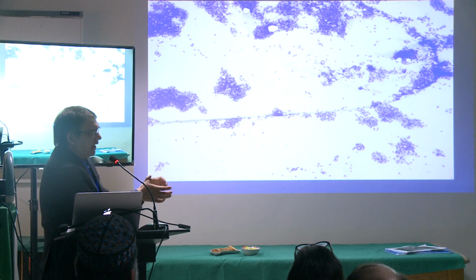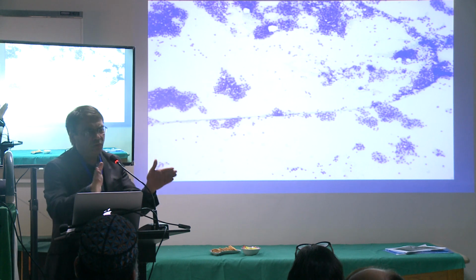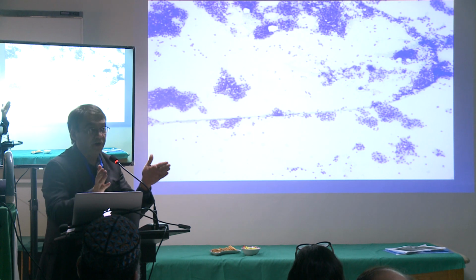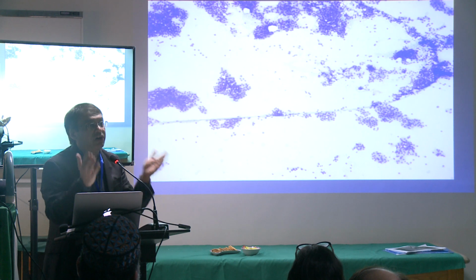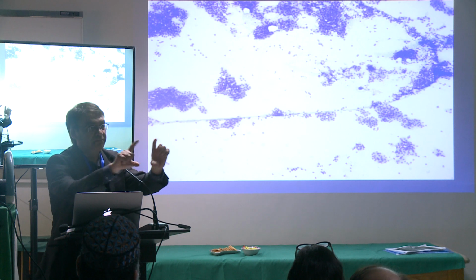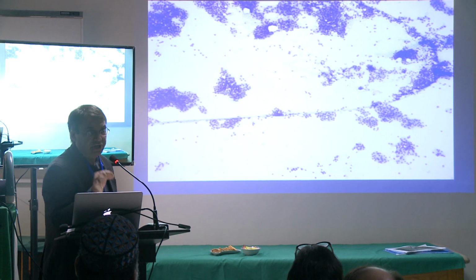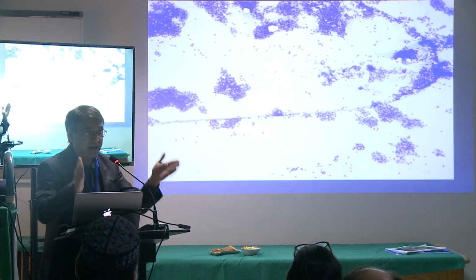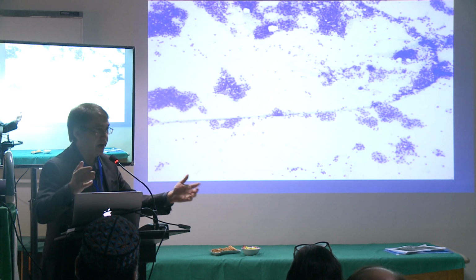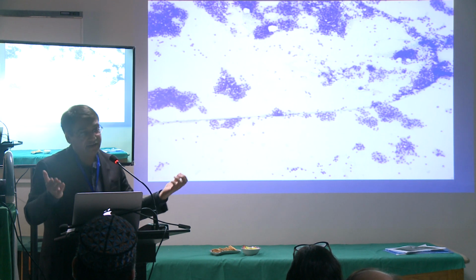This is the FNA. I will talk about the FNA technique, the way I use it, and at the end of the talk, or in between, I'm going to tell you one thing: you just do what works for you. This person is doing what works for them. At the end of the day, the bottom line of every FNA, FNB is that nobody cares that your needle is in the lesion. The only thing they care about is whether the lesion is in the needle. So whatever it takes to get the lesion into the needle, you need to do that. Everybody will have variation in their FNA and FNB technique. I can tell you the way I do it. And at the end of the day, you need tissue.